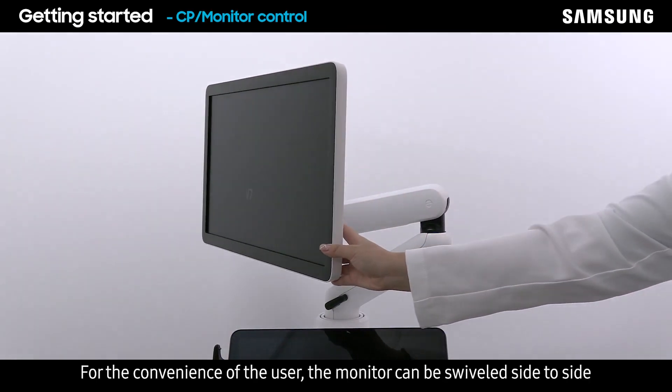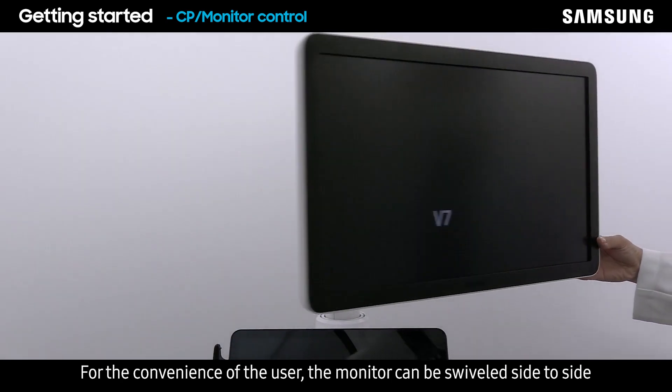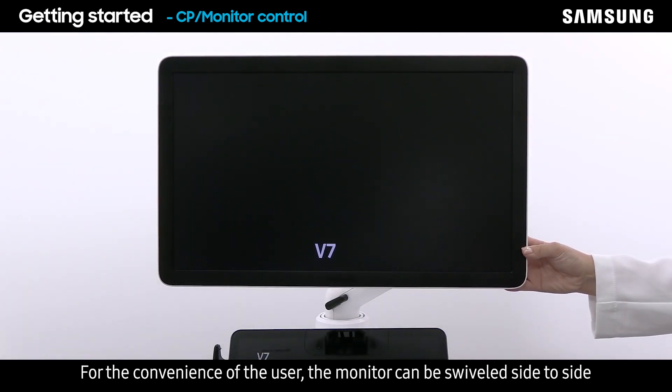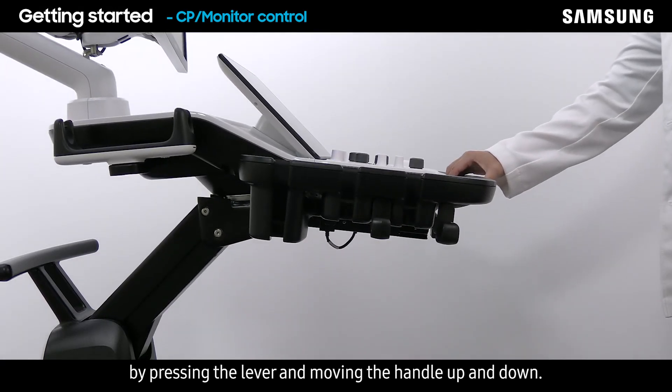For the convenience of the user, the monitor can be swiveled side to side. The height of the console can be adjusted by pressing the lever and moving the handle up and down.